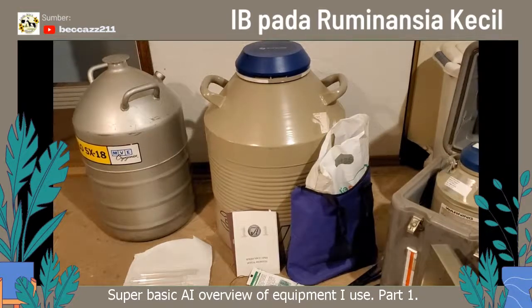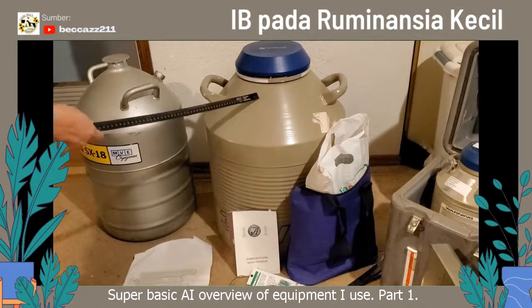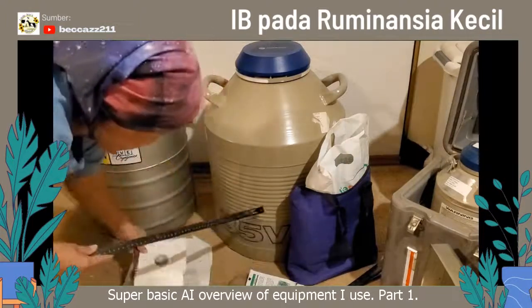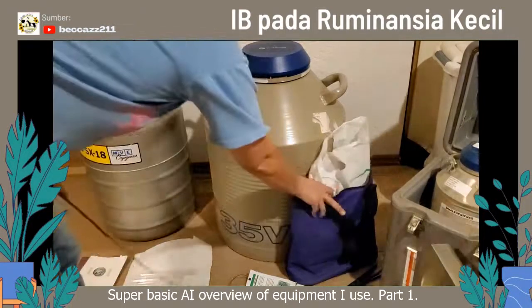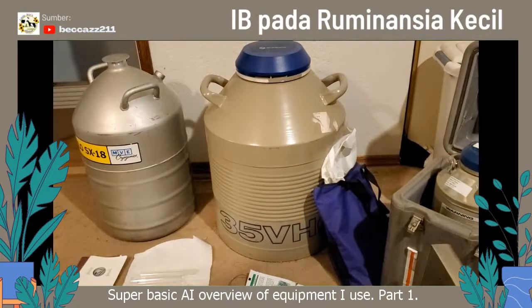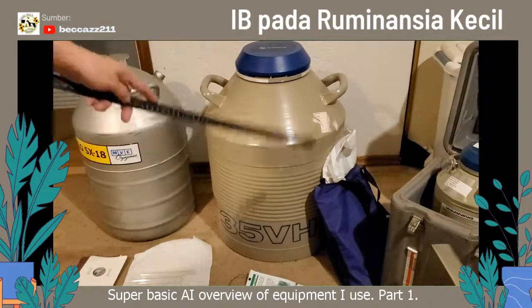The first thing you're going to need is a tank of some kind. This is a very big tank — this is a 35 VHC. Those numbers on the tank mean something. The 35 is the liters. VHC stands for Very High Capacity. So you're going to be able to store a lot of semen in here, but it's going to take a lot of nitrogen and it's not going to last very long.